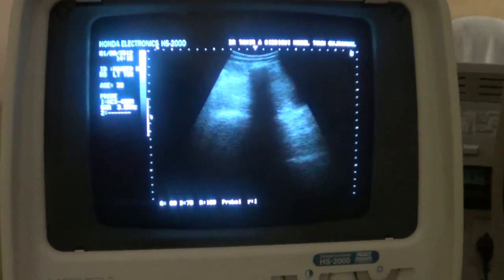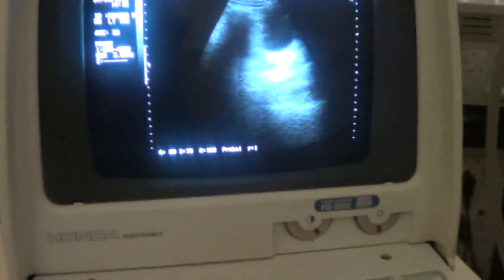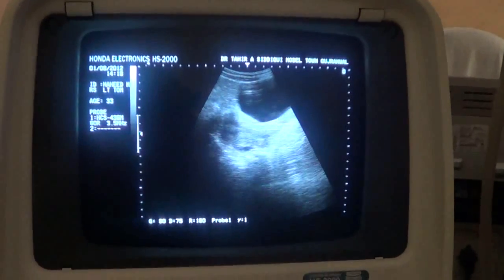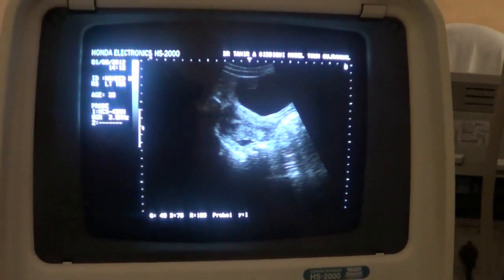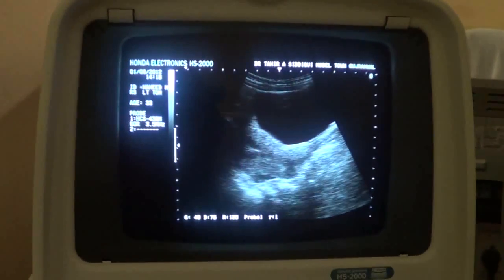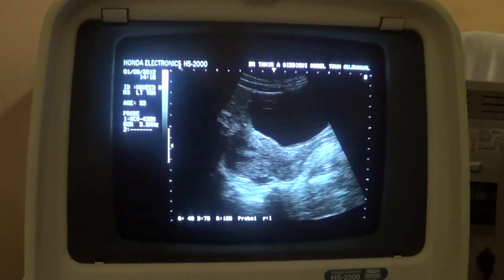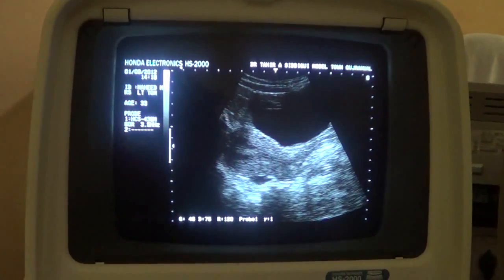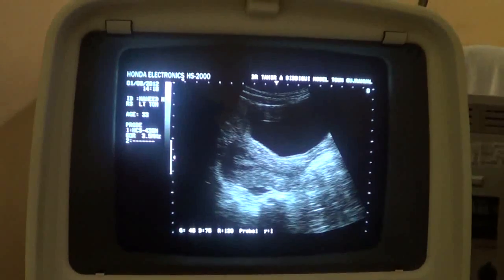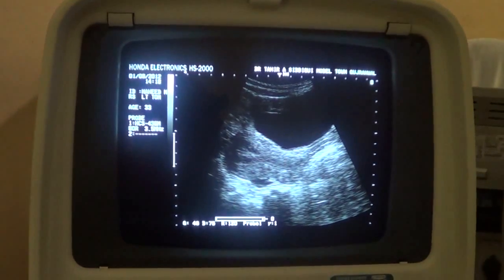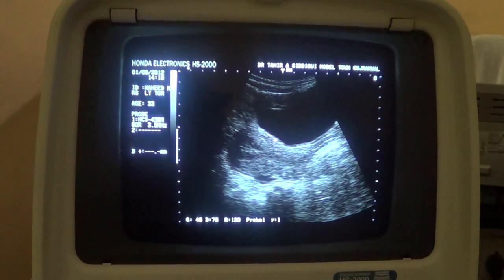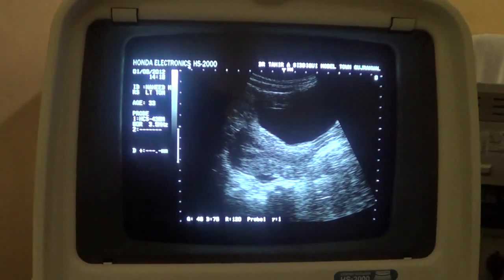This is the female pelvic region study. What we are seeing now is a uterus in a sagittal section, with the urinary bladder anteriorly, and aligning the uterus with the vagina. This is the urinary bladder, and this is the anterior wall of the uterus.